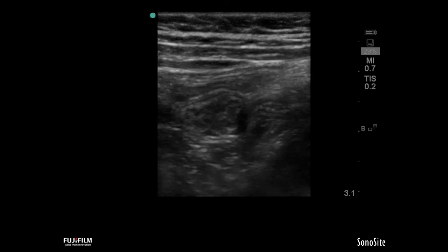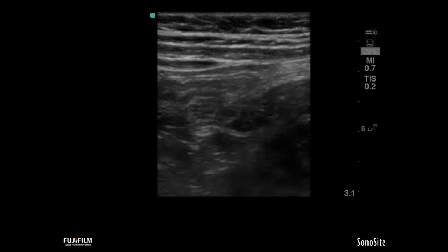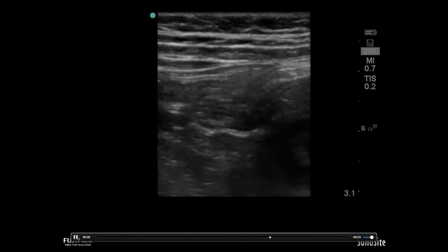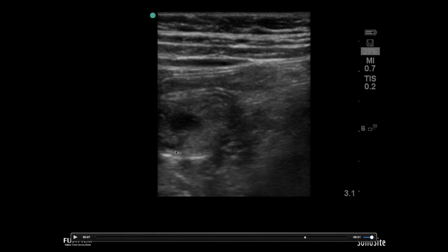Remember that 2.5 centimeters is the minimum number to identify ileocolic intussusception. What looks like normal peristalsis may be small bowel, and if you see something less than two and a half centimeters on screen, it's small bowel. If you think something might be small bowel intussusception, give your hand a rest — don't move at all. See if that image just moves out of view, which tells you it's small bowel intussusception. You can also provide a little downward pressure to squeeze it out of the way. Small bowel intussusception is rarely pathological — it's routinely seen and quite transient.